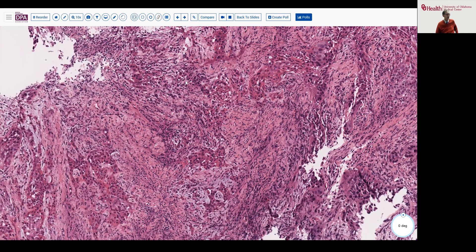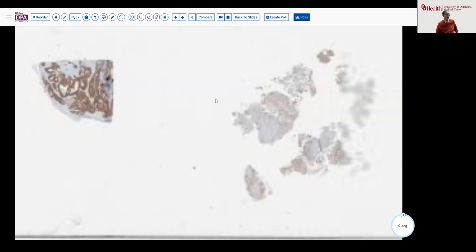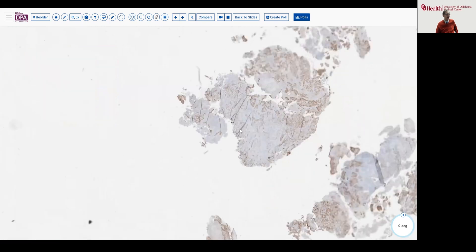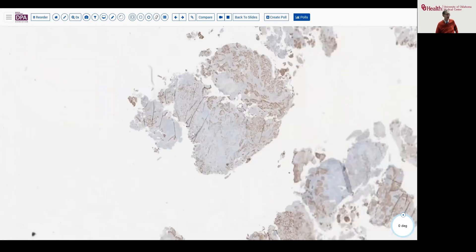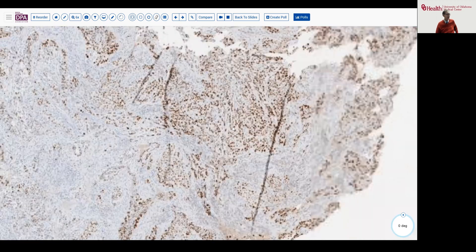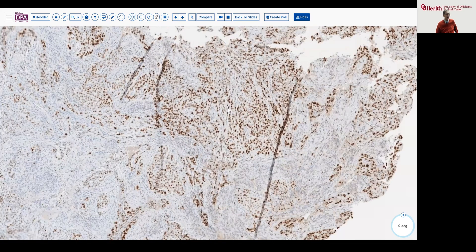The first stain we'll look at shows some positive staining in our sample. At higher magnification, you'll recognize that this is a nuclear stain. This could be one of two things — a squamous marker like P40 or P63 — but in this case, this is P53.